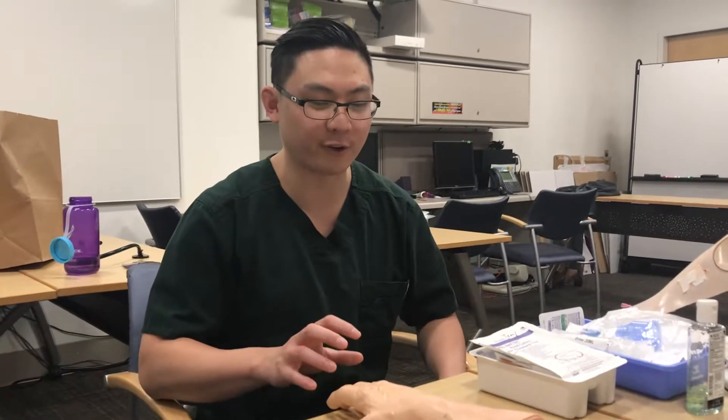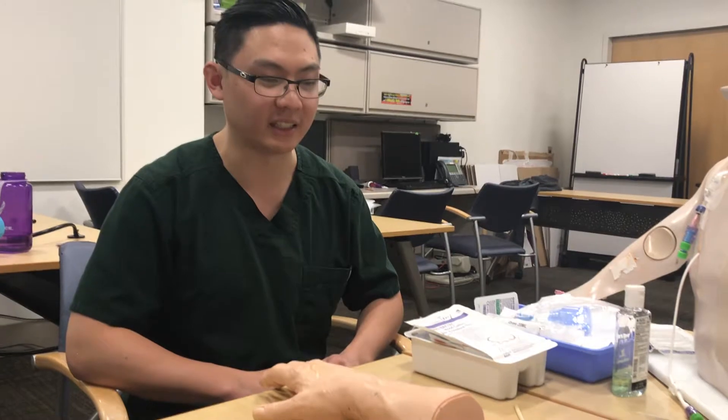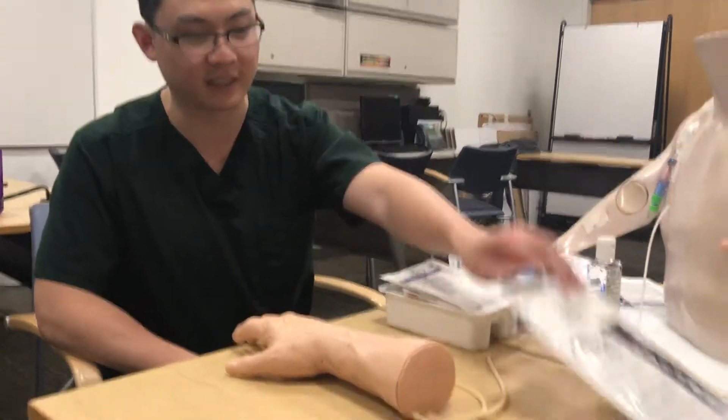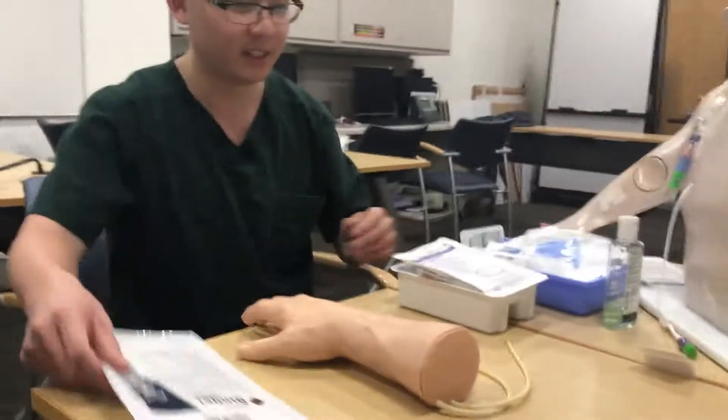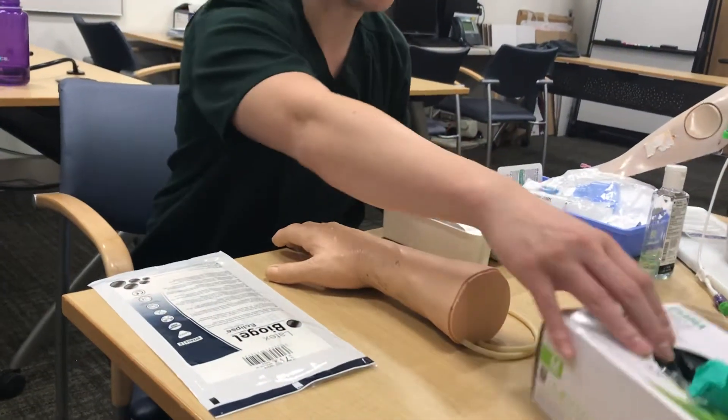We're going to go over how to do blood culture kits today — not just for a peripheral stick but also for a central line. First, you're going to need a pair of sterile gloves, possibly another set, the blood culture kit itself, and a non-sterile glove as well.